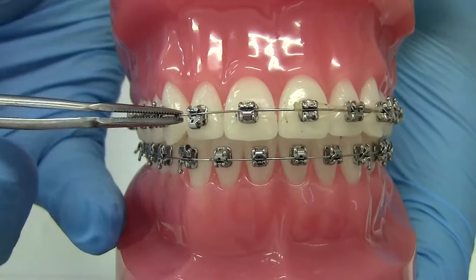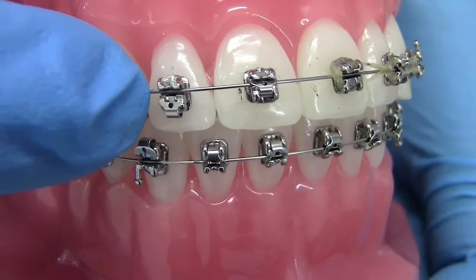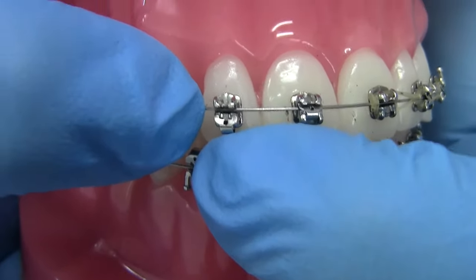If your bracket is open and your wire is moving freely, follow these simple steps. Place one finger on either side of the bracket to ensure that the wire is properly placed in the bracket slot, using another finger to push the gate closed.